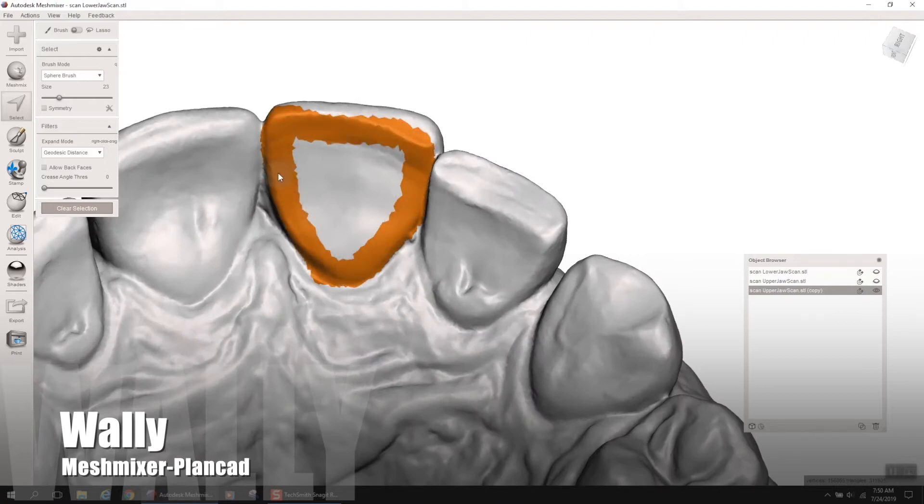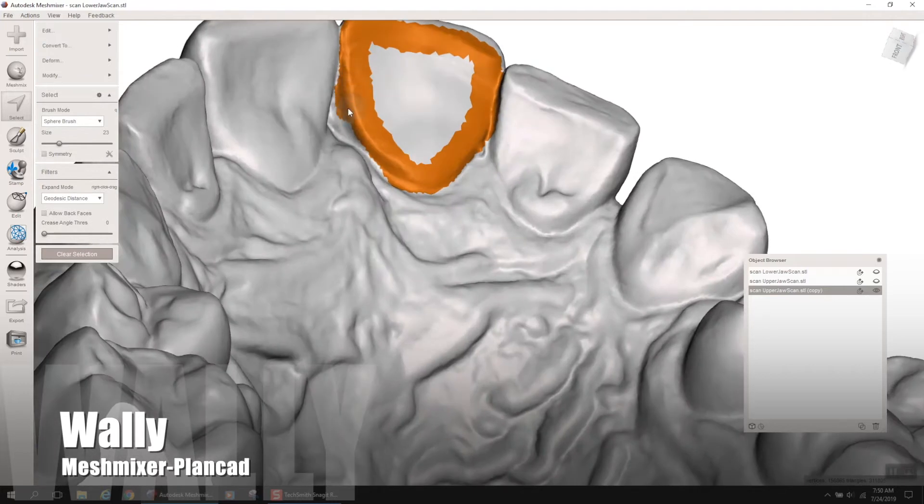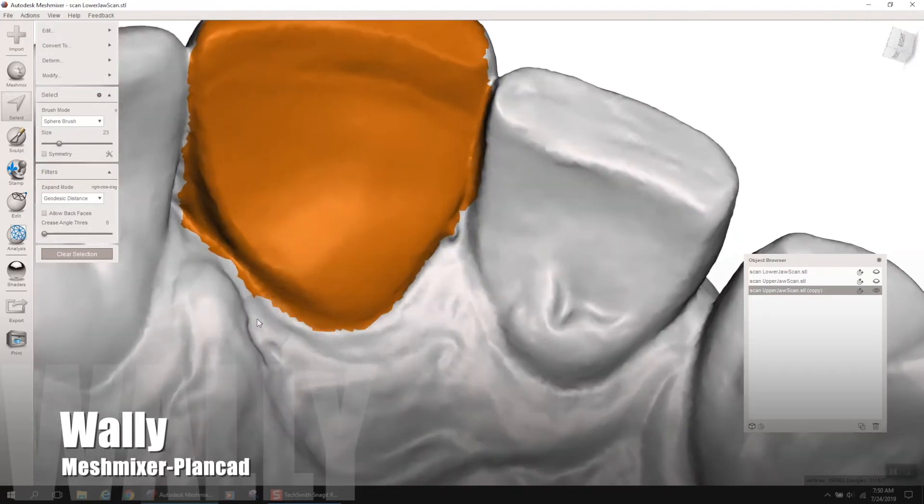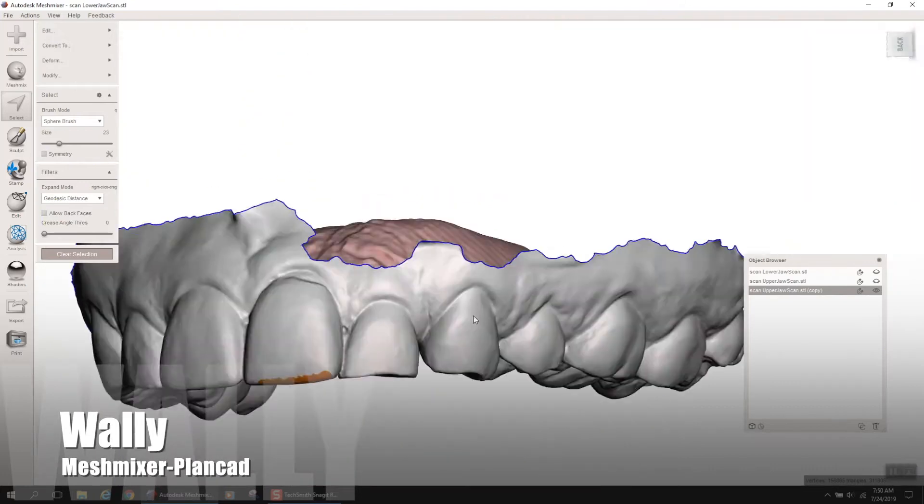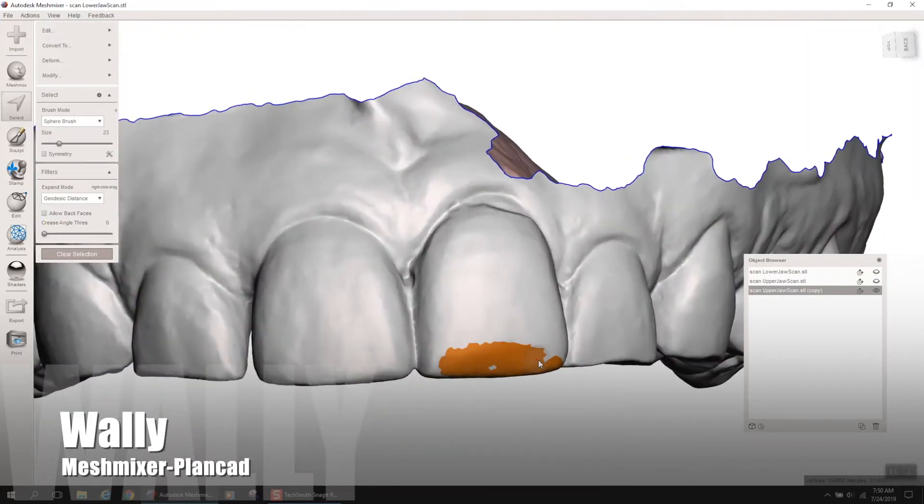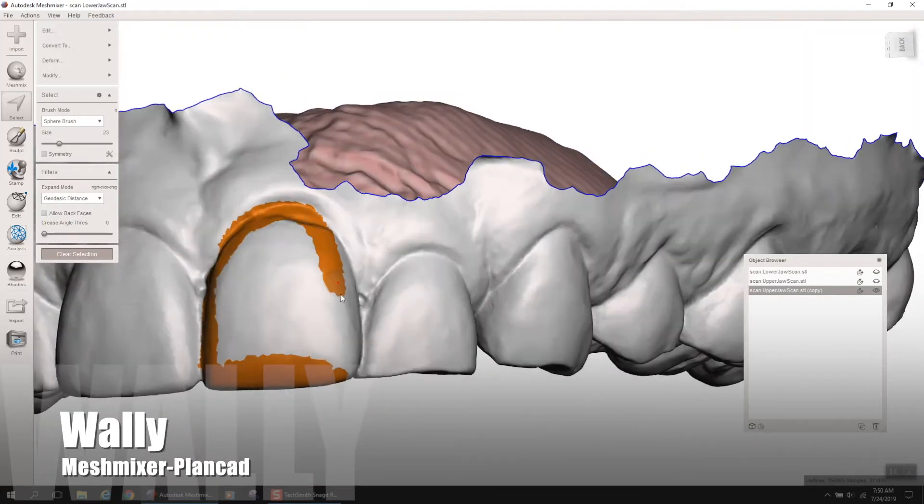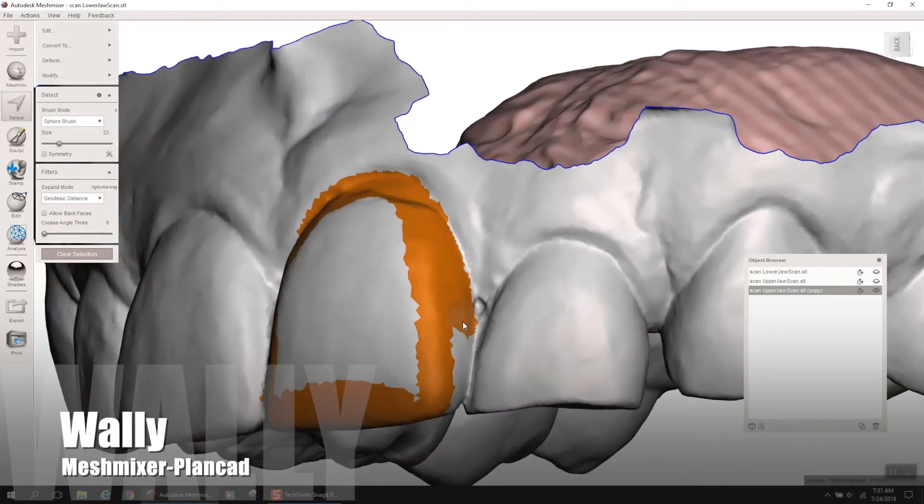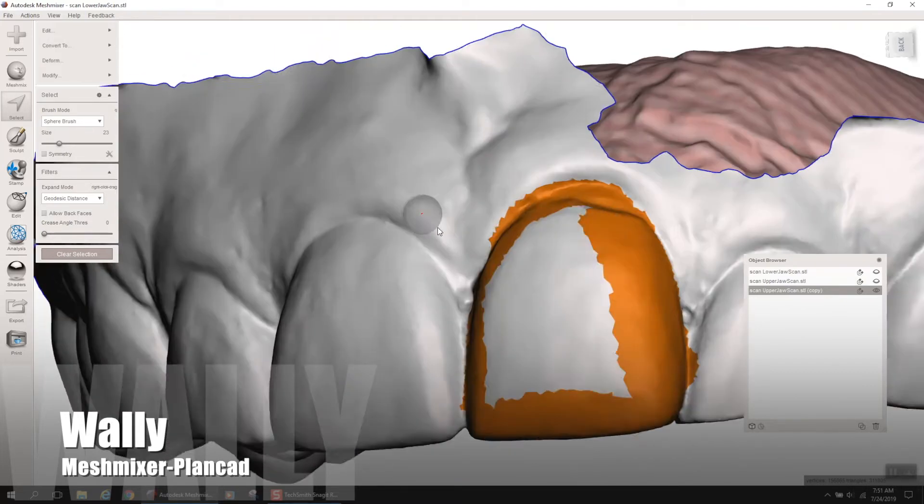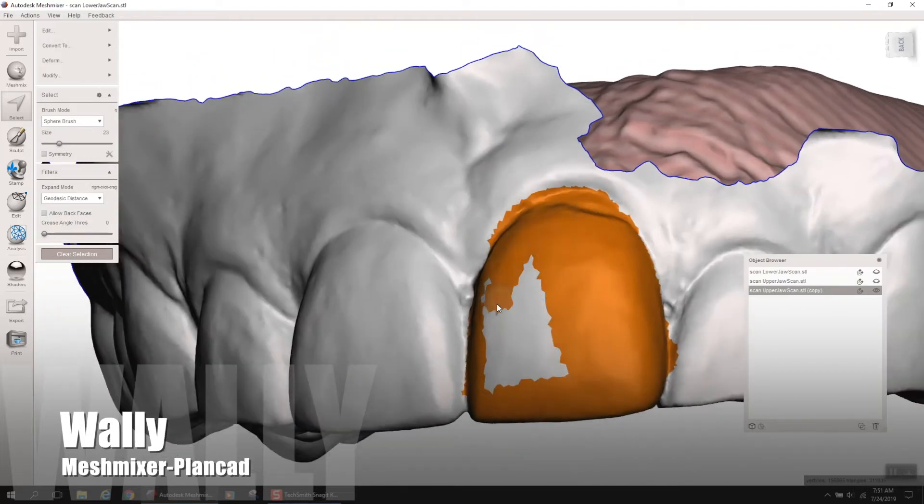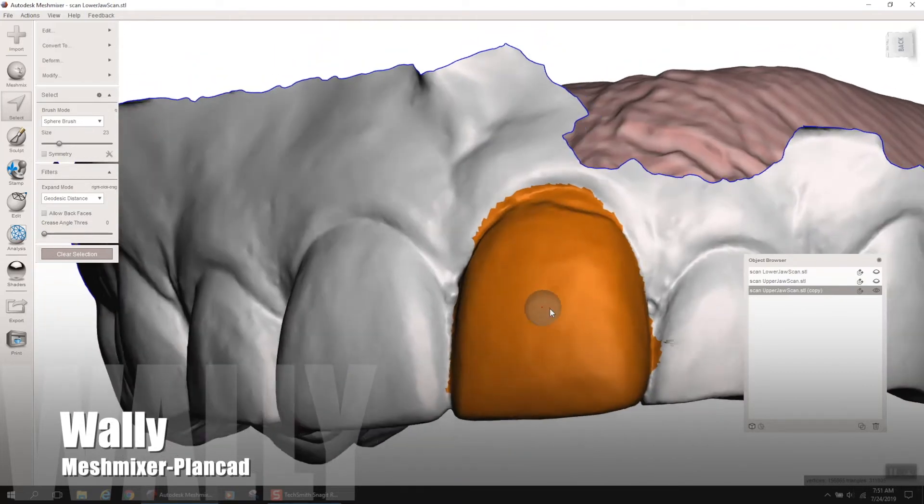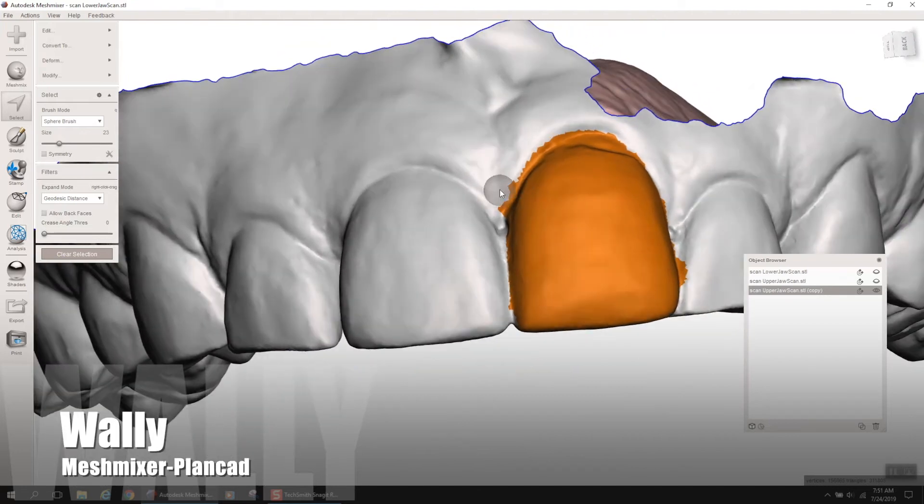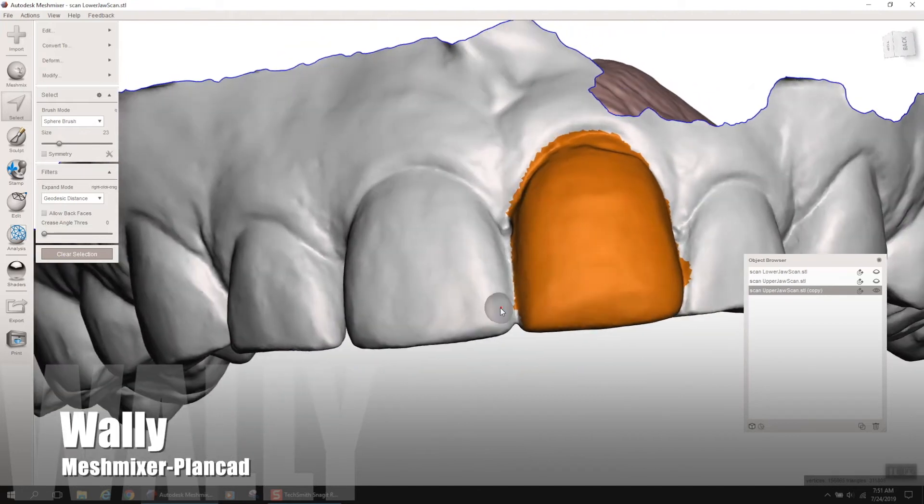So here what I'm doing now is I'm in Mesh Mixer. I've loaded my intraoral scans, and I'm just selecting, using the select tool, the entire tooth. Take your time, go around, and try to get it as smooth as possible, and just focus on eliminating the tooth that you're going to be extracting.